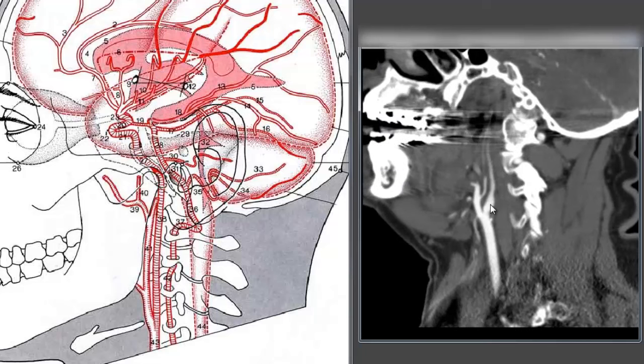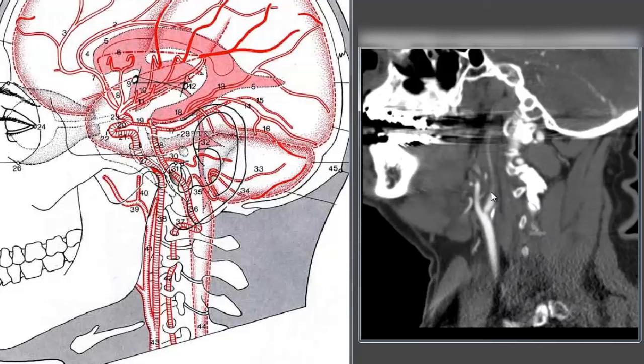So it looks like there's a tapered narrowing to the vessel but that's not actually the anatomy of the vessel, that's a functional consequence of the carotid terminus occlusion. This is often referred to as a functional internal carotid artery occlusion from the perspective of the cervical portion, the neck portion of the internal carotid artery, but in fact it's an intracranial carotid artery occlusion distally at or near the terminus and it's causing a failure of the contrast to make it out.